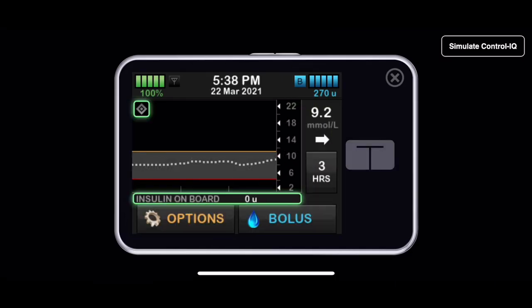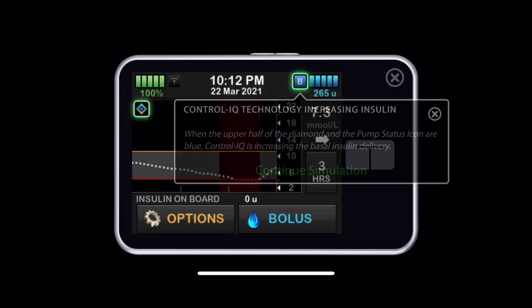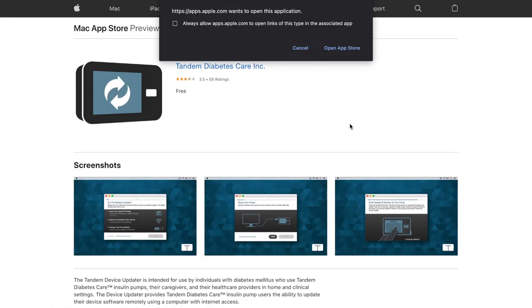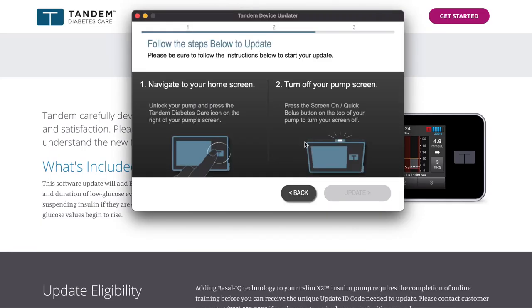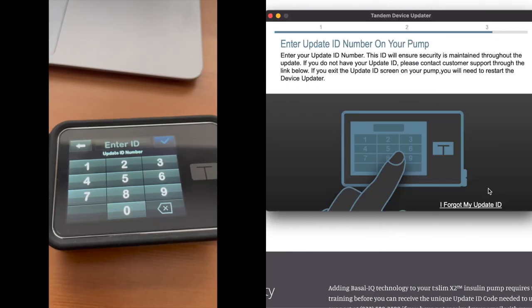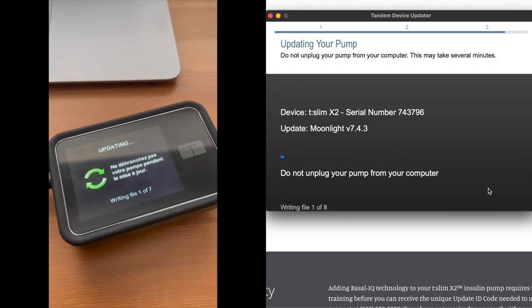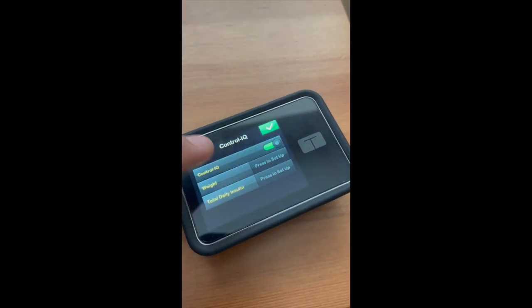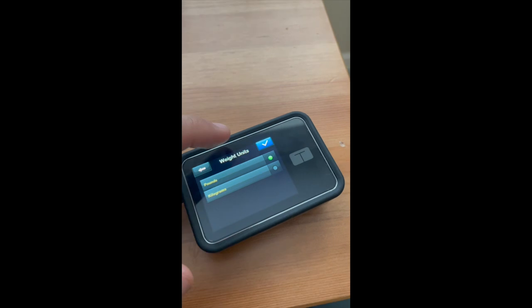First, let's compare setup. When you buy the T-Slim pump, Tandem offers pump training with a certified diabetes educator, and they even have a simulation app where you can learn how to use the pump from your phone. My pump did not come with Control IQ installed, so I had to update the software myself. My local pump rep emailed me a link to complete an online training module. I got a certificate when I was done and had to email it back to the pump rep in exchange for an ID code that would allow me to install the new update.